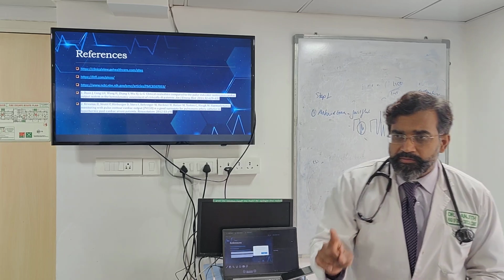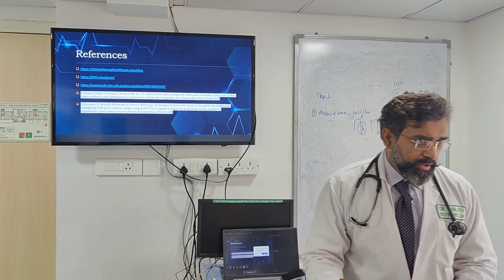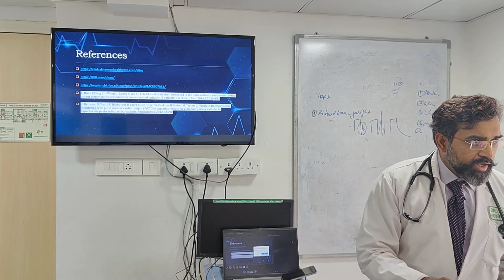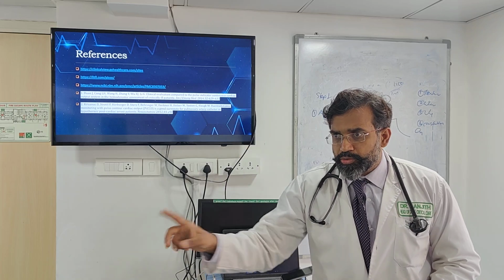We don't have one nurse. We have 45 nurses in our ICU. Every nurse is different. That's why you need to figure out whether this nurse is doing the right thing, provided you know what is the right thing. Understanding? That is why it is wrong to get a thermodilution done with a nurse on her own, at least in our hospital.